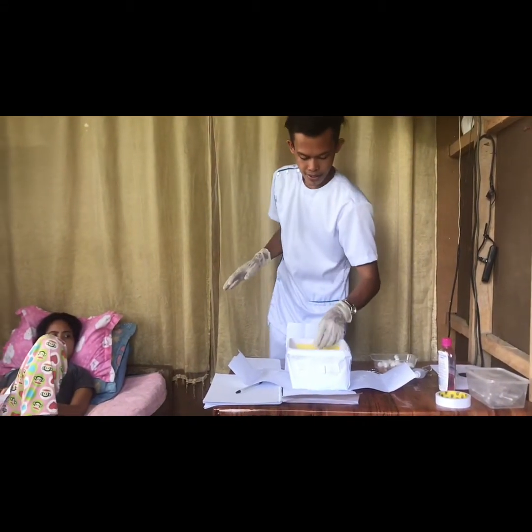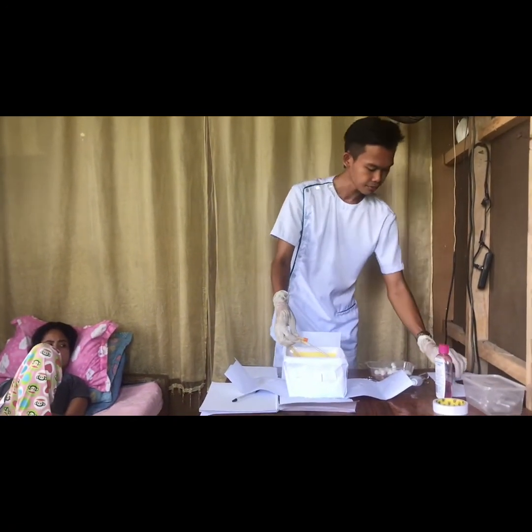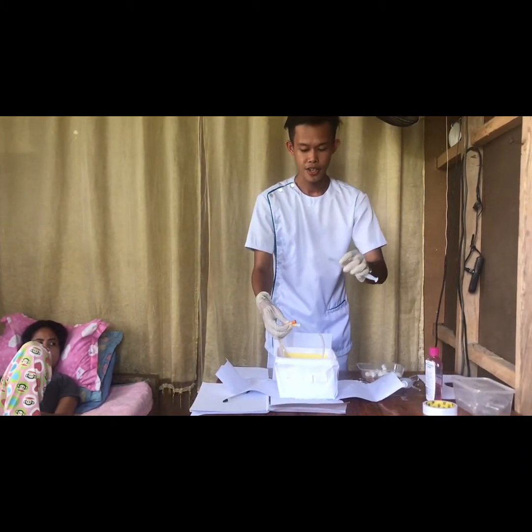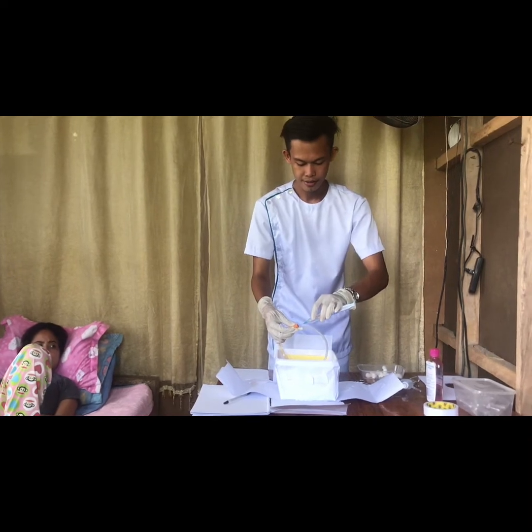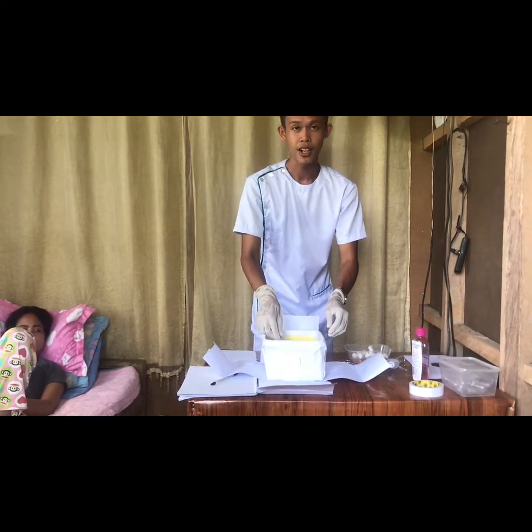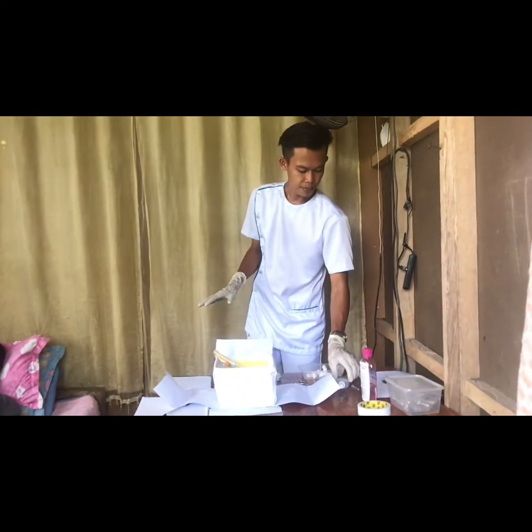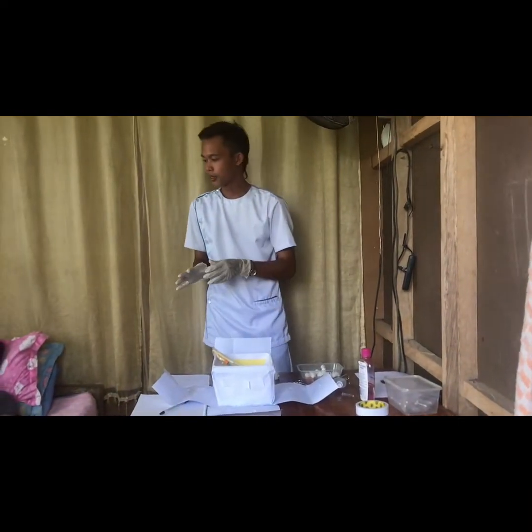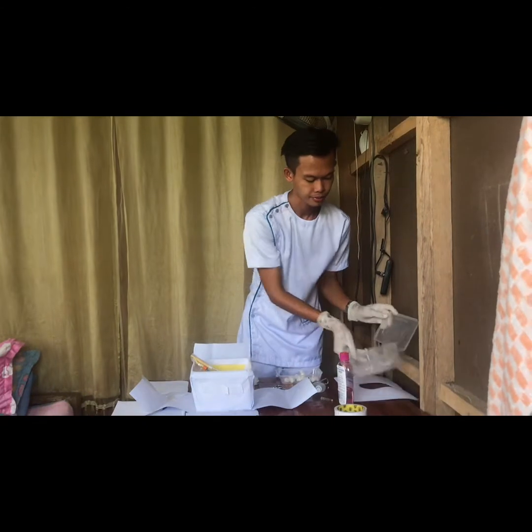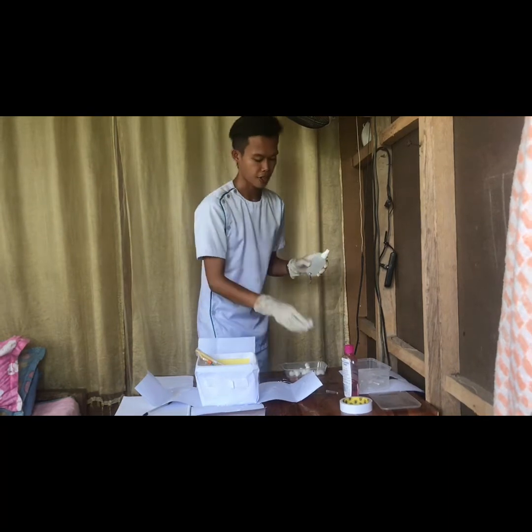Okay, so the next thing we're going to do is insert the 10 cc syringe to the catheter, size 16. Okay, so this time the catheter and the 10 cc syringe are now connected. On the other hand, I'm going to have the second stage of the cleaning. So I have here the alcohol swabs, and then also we have the lubrication spray, and then we have the lubrication cup.